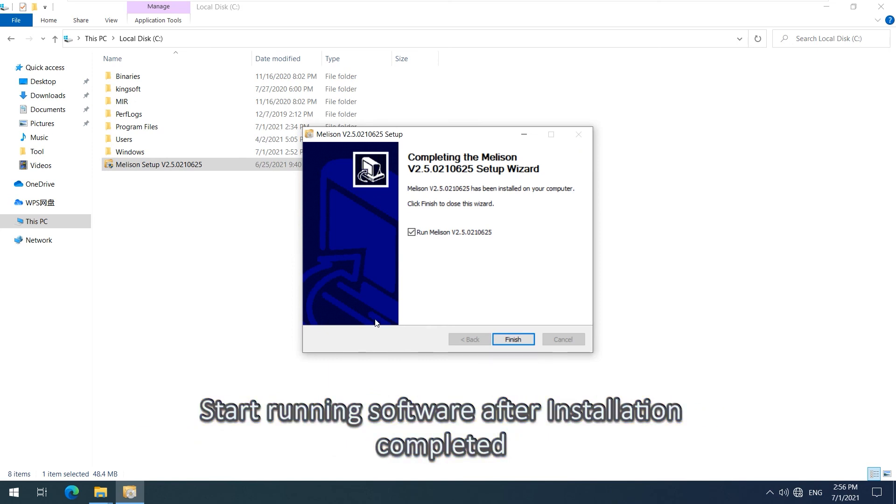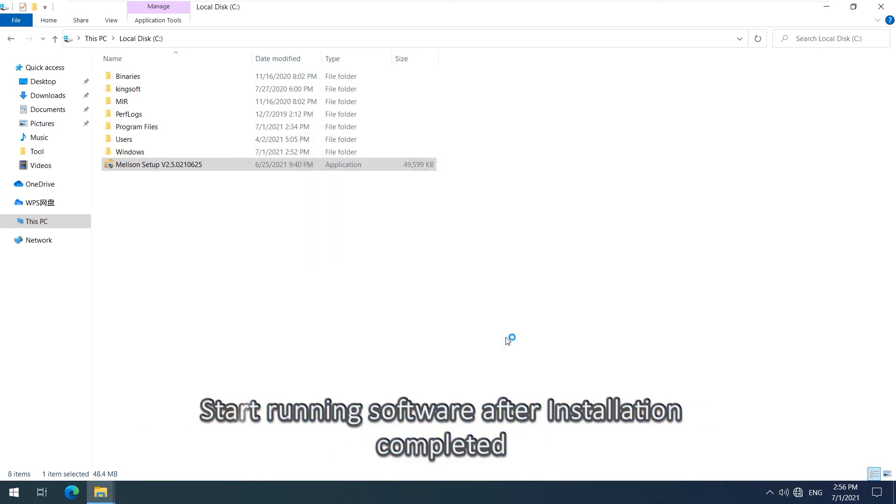After installation is completed, start running the software.